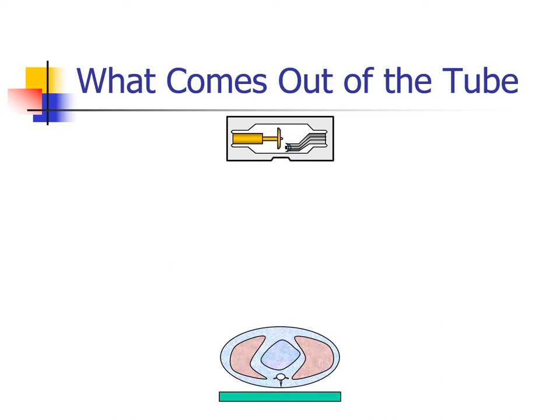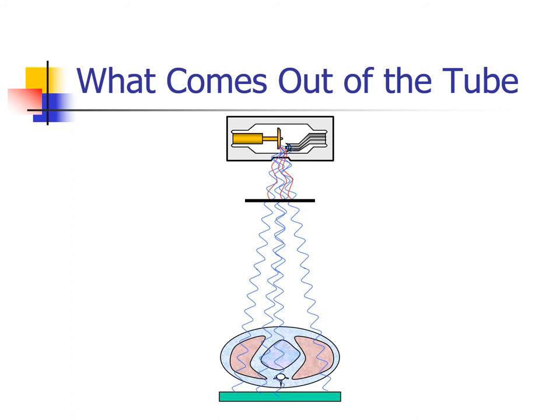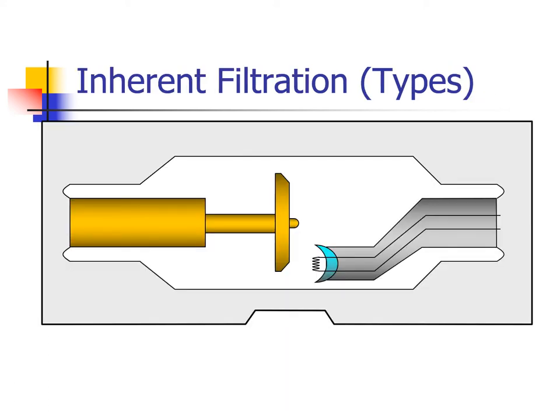To our system, we will add a simple 2.5 millimeter sheet of aluminum to the sample machine between the patient and the tube. Note what happens. The lower energy rays, which are red, are stopped by the filter, and the higher energy rays, blue, can pass and contribute to image formation. So far, the question of why we filter is straightforward. To achieve a dose reduction for our patient with little change to image quality, adding a filter to the beam makes the beam more homogeneous and more of the remaining rays contribute to image formation.